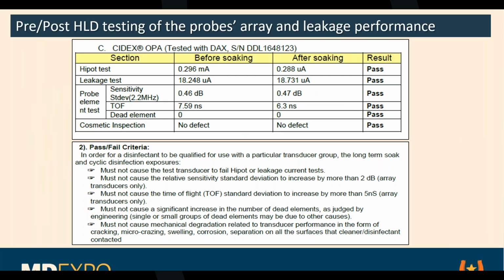Getting in a hurry, instead of placing it in carefully, they treat it like a rental car and jam it in, and there are things in there that can tear the skin on the probes, causing electrical leakage.